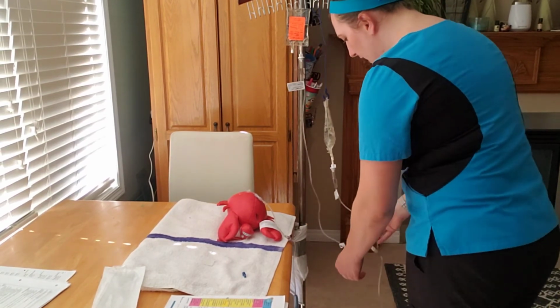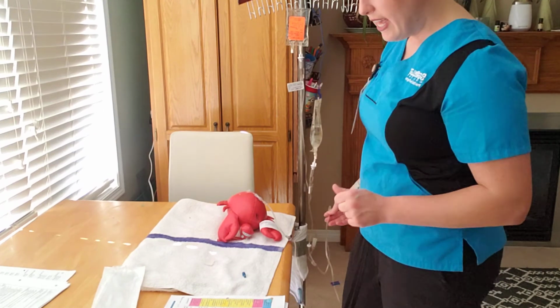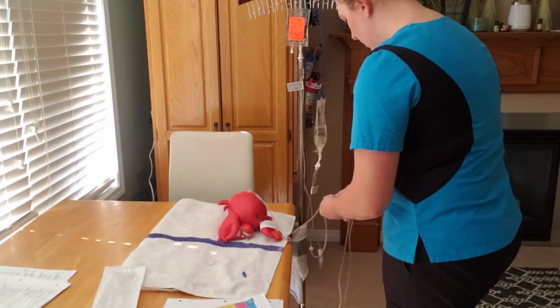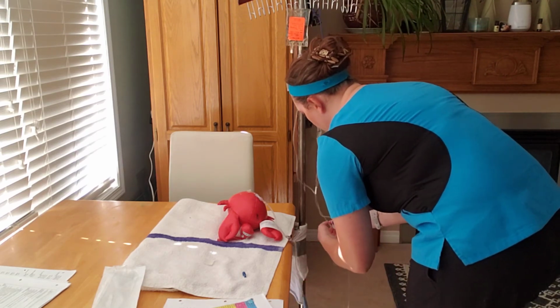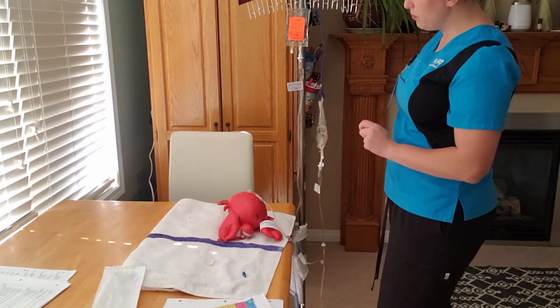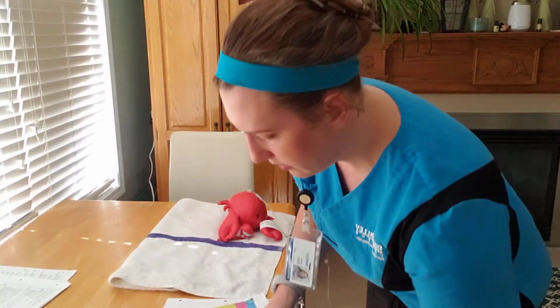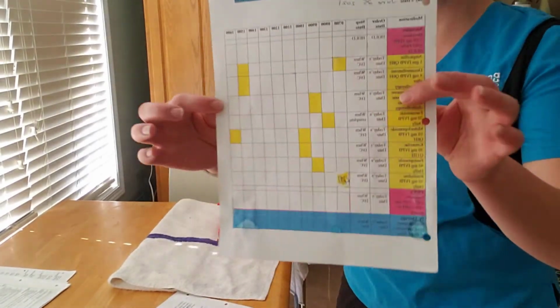So now that I have that, I'm going to set my pump. So I'm going to click that in there, and I'm going to program the rate of infusion at, I'm just going to double check, 156 milliliters per hour. Okay. So open that up, and I'm noticing that I've got at least 2 drips in my drip chamber. So the medication is running smooth. Again, no air, the line looks good. Okay, so I'm just going to clean my mess here. Sign my MAR, JM, and the date is June 25th at 0700 hours.